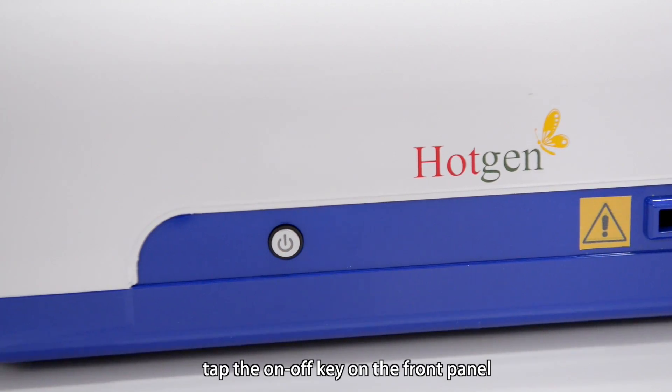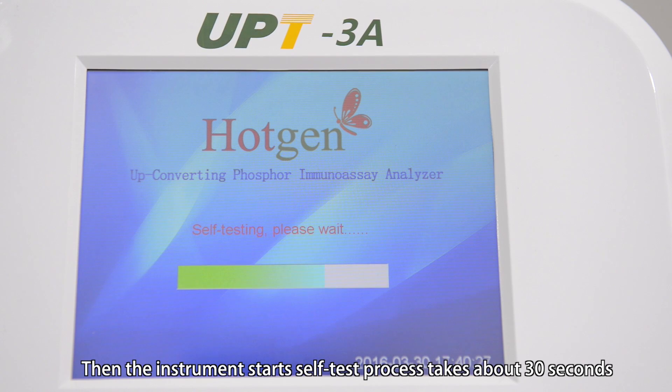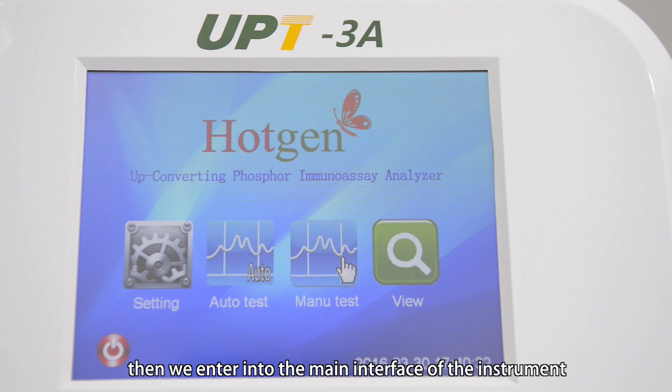tap the on-off key on the front panel. Then the instrument starts self-test process, which takes about 30 seconds. Then we enter into the main interface of the instrument.